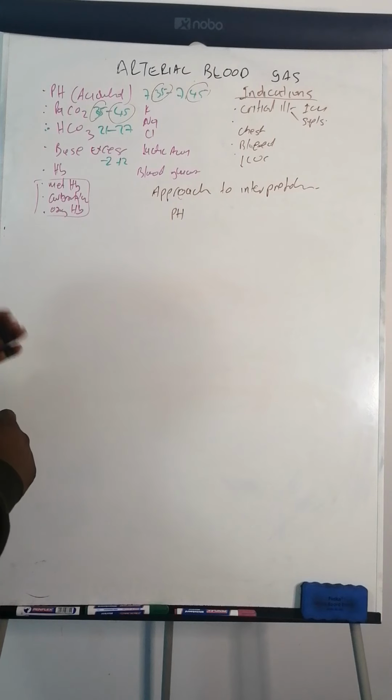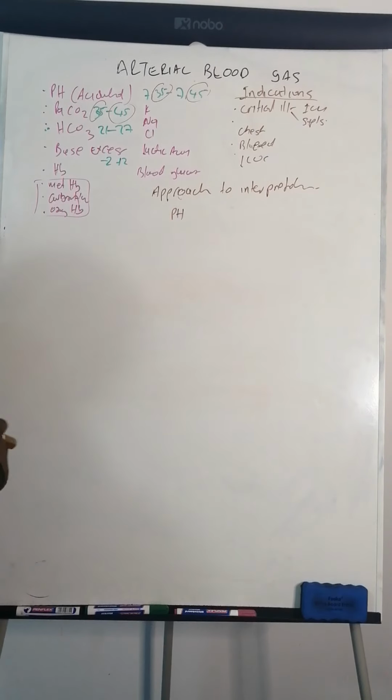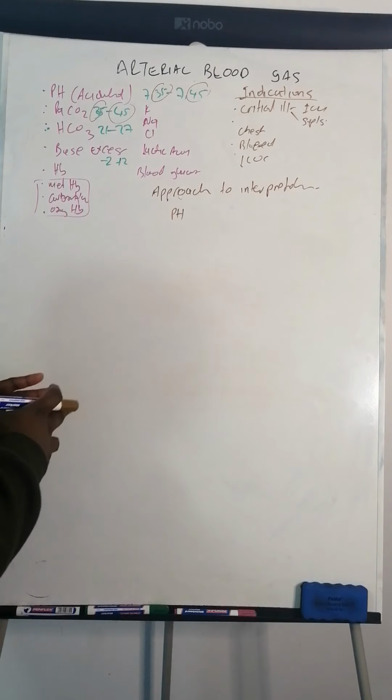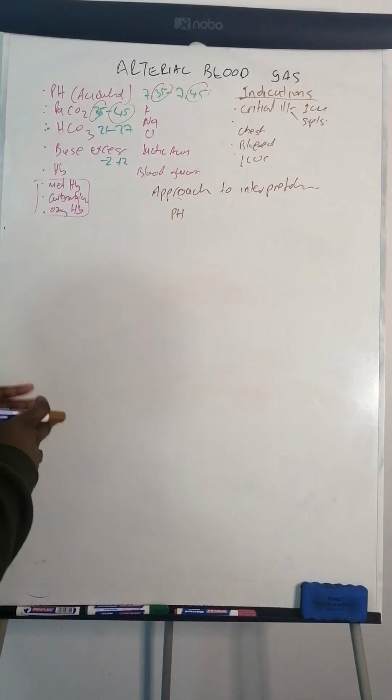The minute you get to 37.8 and to 38, then that's a very high temperature. And also the reason why you shouldn't have hypothermia, this is one of the reasons. pH balance should be within the normal ranges. Temperature should also be within the normal ranges.